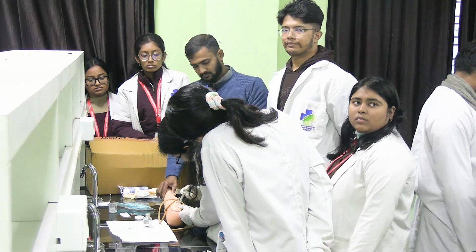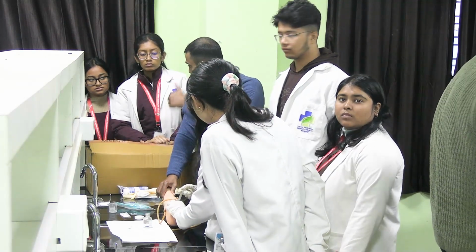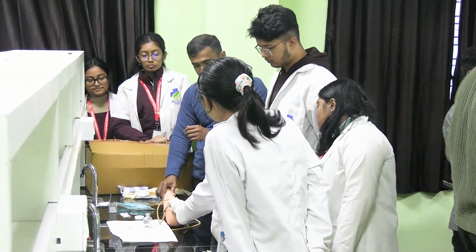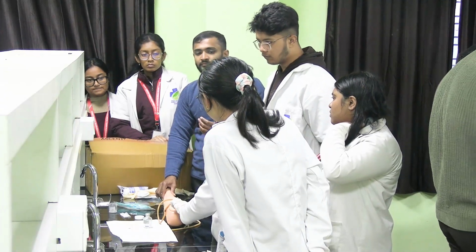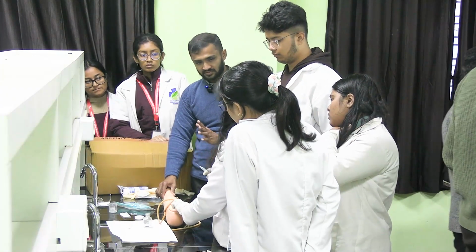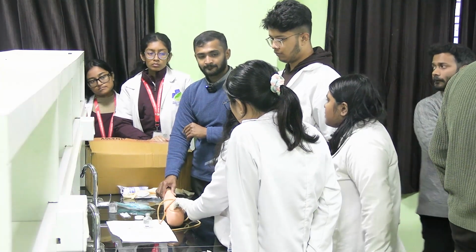What is the next step? After introducing the drug, only then you release the non-dominant hand, the stretching of the skin, not before that. Now you have to press it gently for 1 minute, then observe the patient for 15 minutes. After that, I have to assure the patient, discard the needle and waste as biomedical waste, then hand wash.